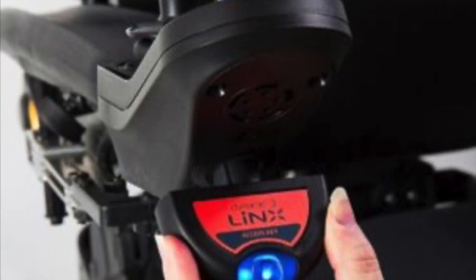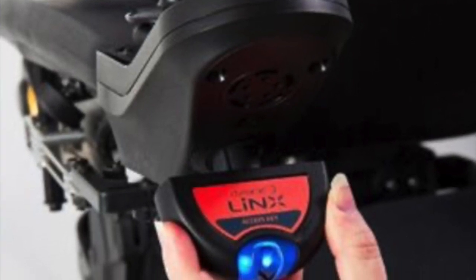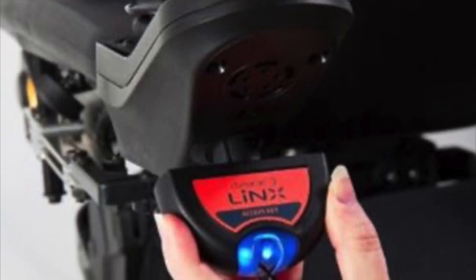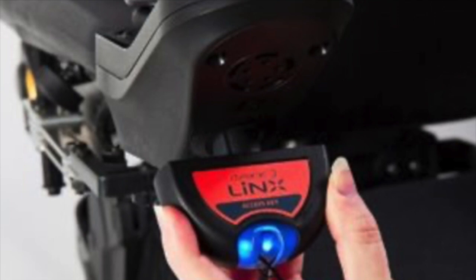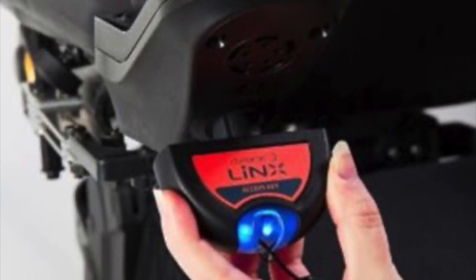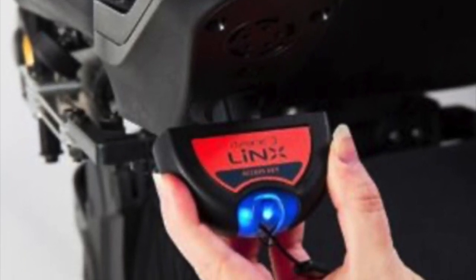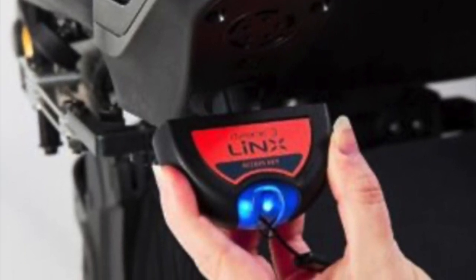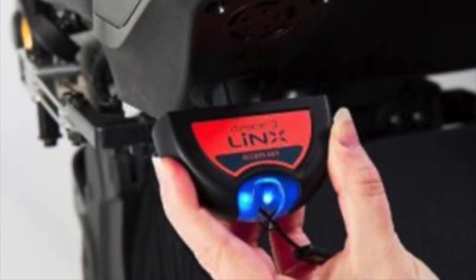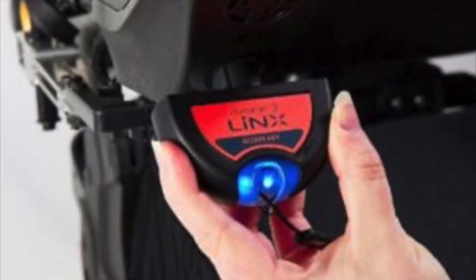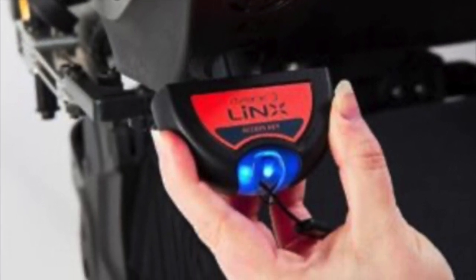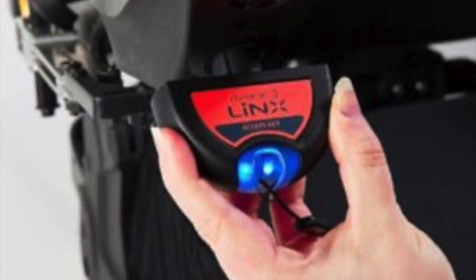After the Lynx Access software has successfully installed, turn on the power chair and plug the Lynx Access key into the charge port on the chair's joystick or display. If you need to obtain a LAC, contact Invacare customer service or your local sales representative.